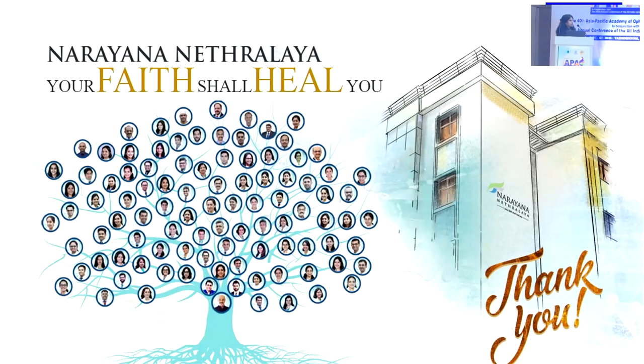Thank you. Just a thought: in the hypoosmolar riboflavin cross-linking, the penetration of the riboflavin may be non-uniform because the cornea is not uniformly thick. So then, the demarcation lines, how superficial or how deep they were, ideally you should measure it on ASOCT and see.